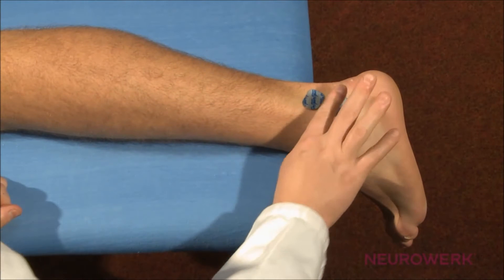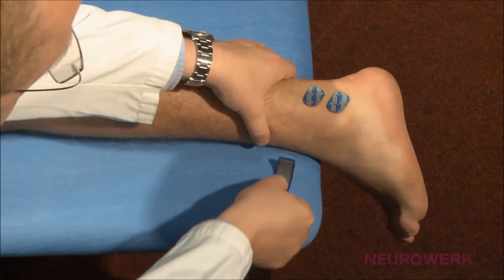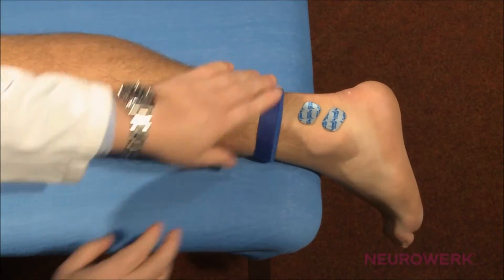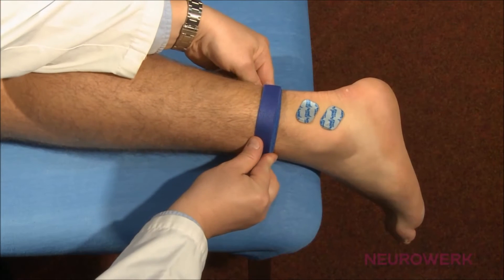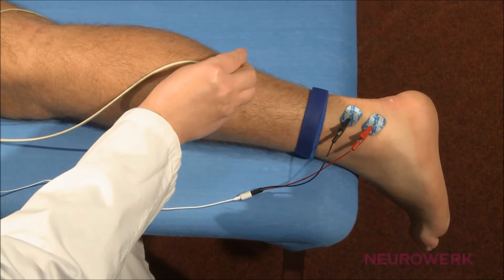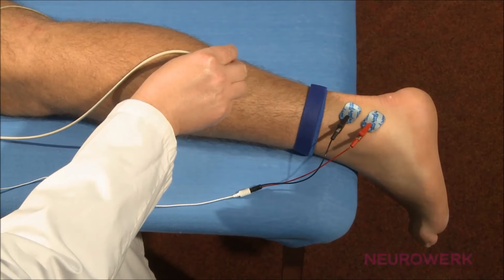The adhesive electrodes are placed between the outer ankle and the heel. The ground electrode is attached between the stimulation and recording electrodes. The nerve stimulation occurs in the nerve path approximately 2 cm lateral to the Achilles tendon.